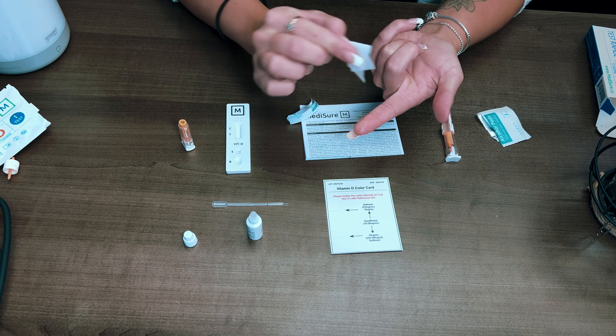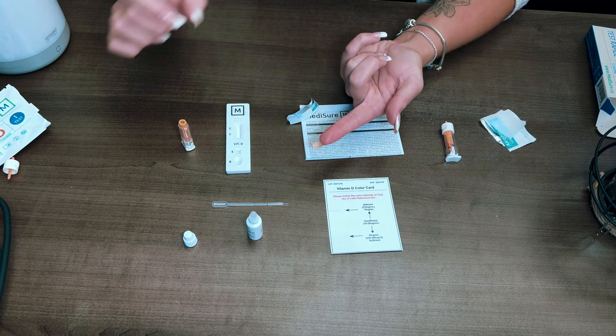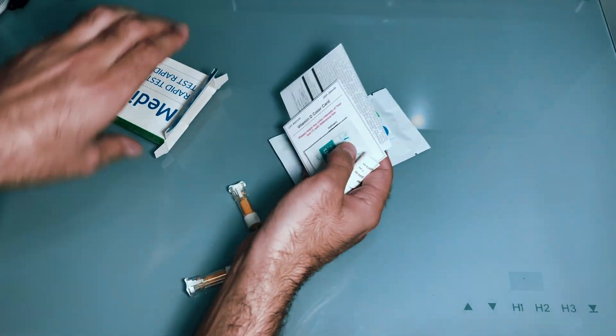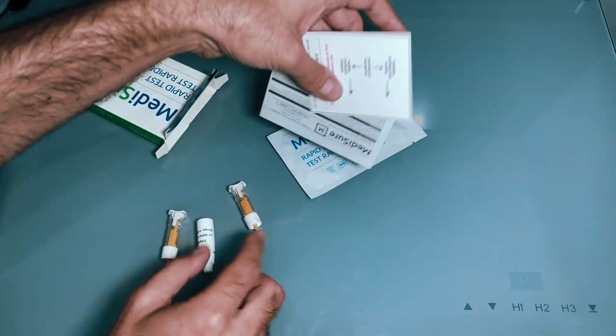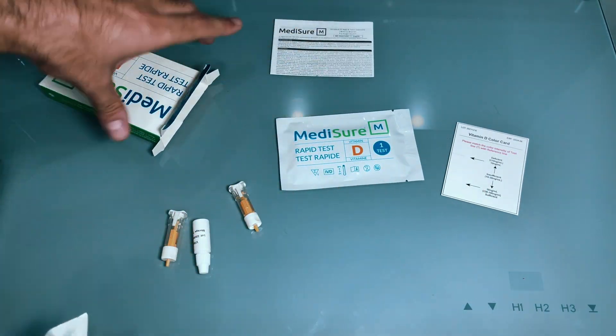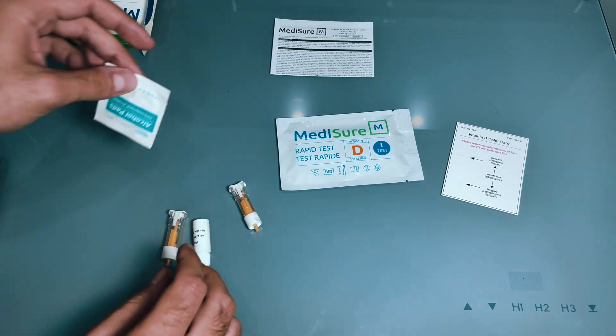Let me show you how I did this test. Inside the box you have the test cassette, the capillary dropper, buffer solution, two lancets, an alcohol swab, a color reference card — which is very important since you'll be referencing your results against it — and the instruction manual.